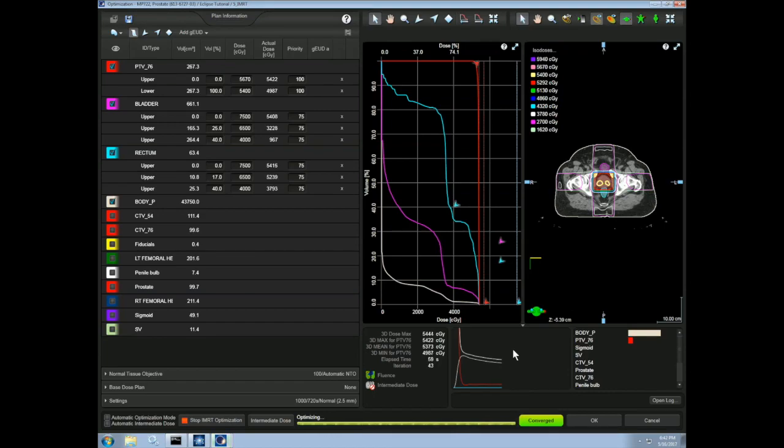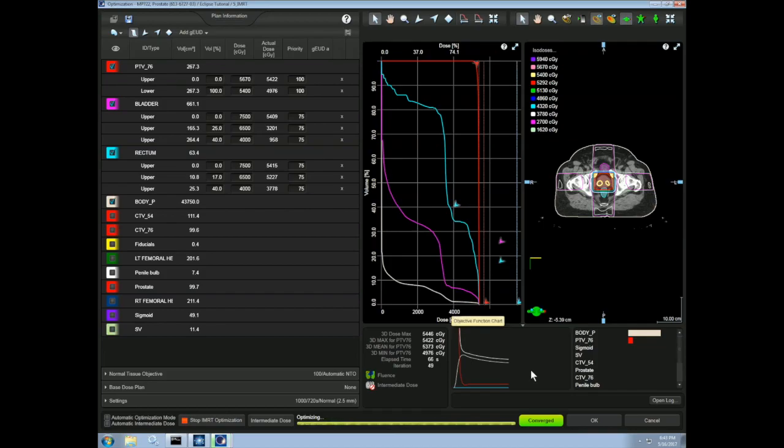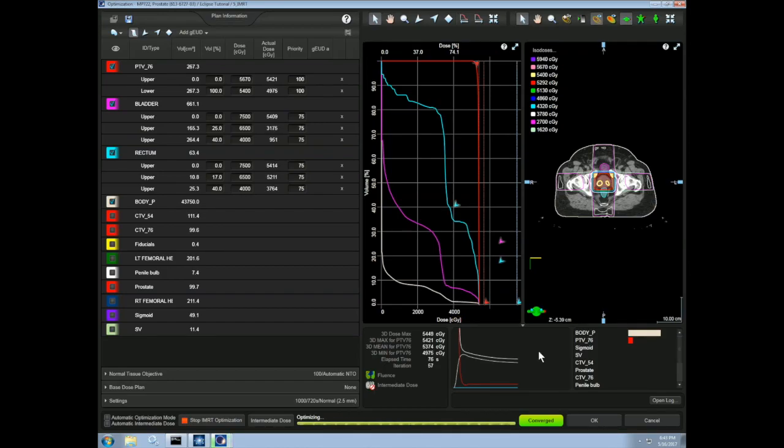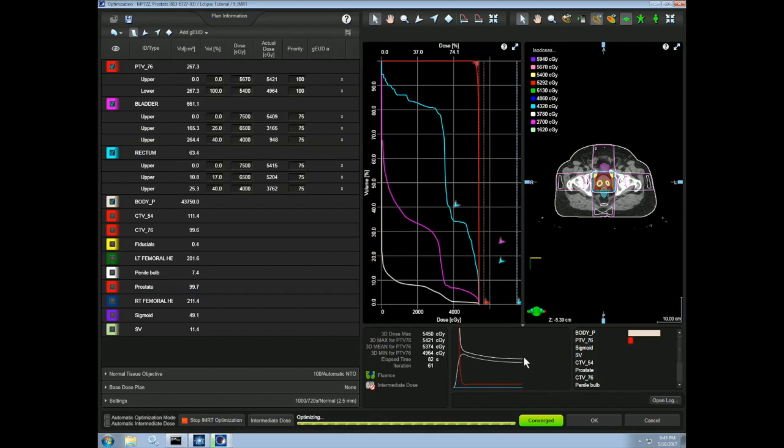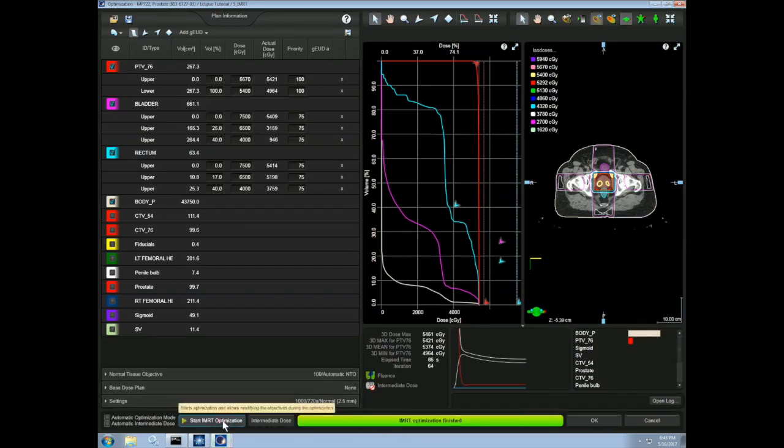We can also drag and drop the constraints to tweak our optimization in real time. But for now, let's just leave them alone. As you see, our cost function has leveled out for each structure. So let's stop the IMRT optimization. Select OK.